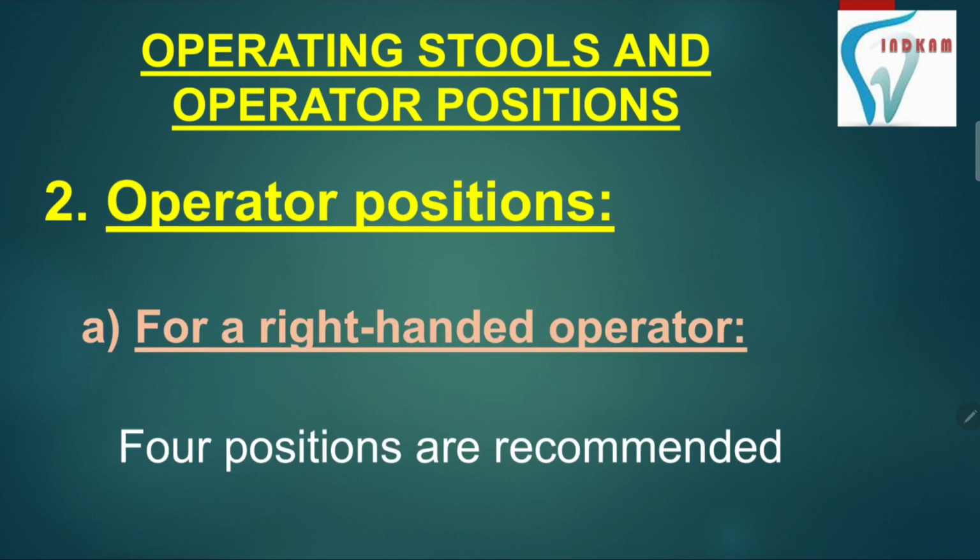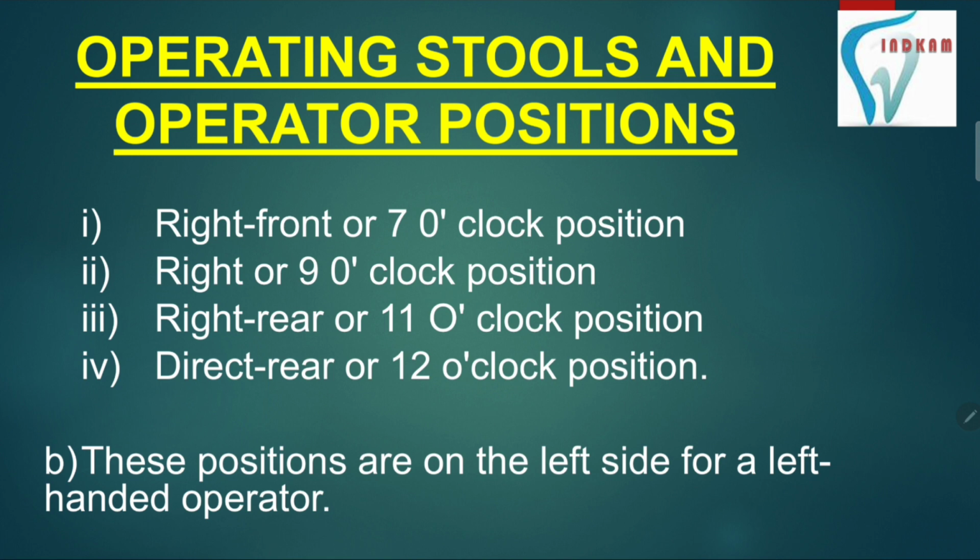Now let's talk about operator's position. For a right-handed operator, there are 4 positions recommended, which are right front or 7 o'clock position, right or 9 o'clock position, right rear or 11 o'clock position, and direct rear or 12 o'clock position. These positions are on the left side for the left-handed operator.